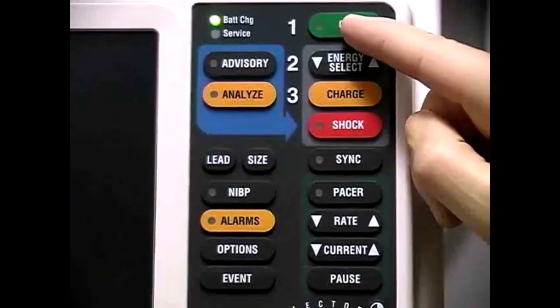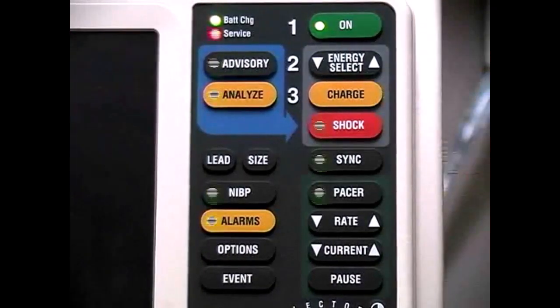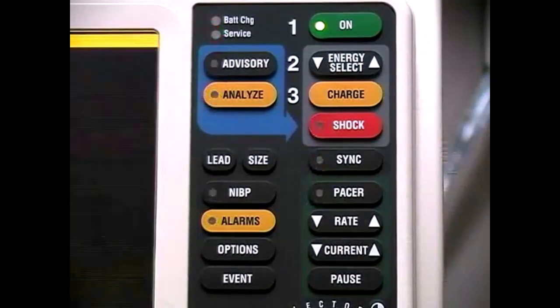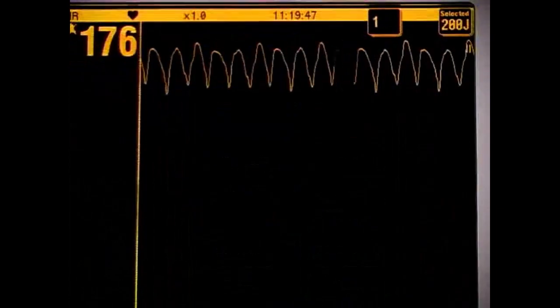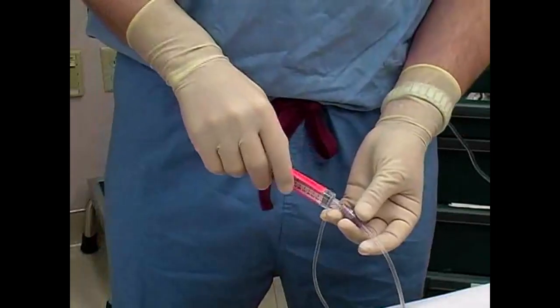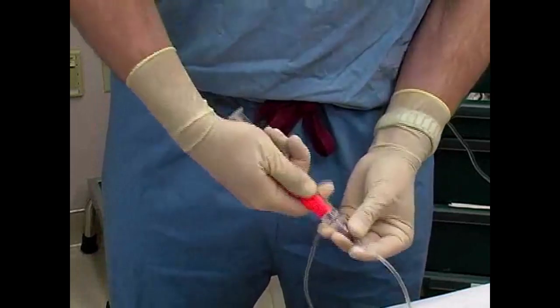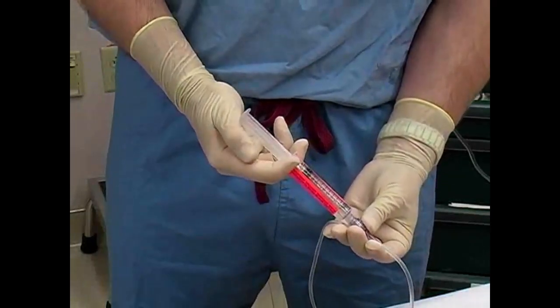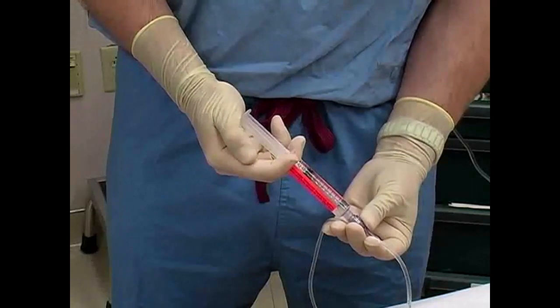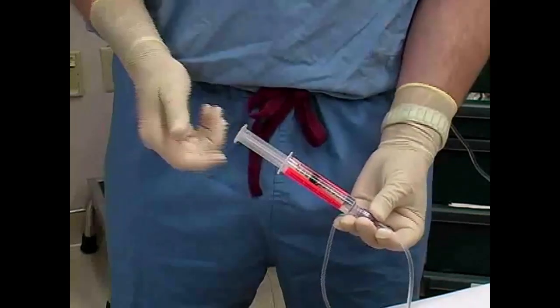Turn on the monitor and confirm the presence of a tachydysrhythmia. Cardioversion is a painful procedure and if the clinical situation allows, consider the use of procedural sedation prior to delivering the countershock.